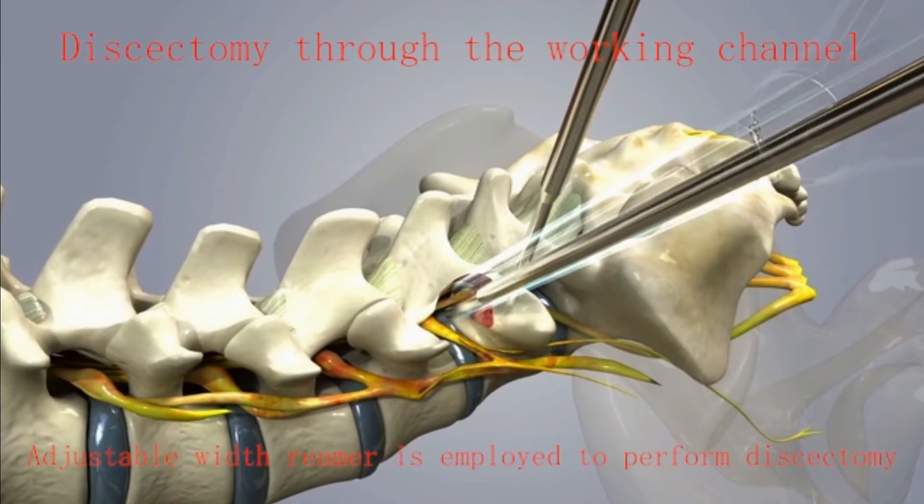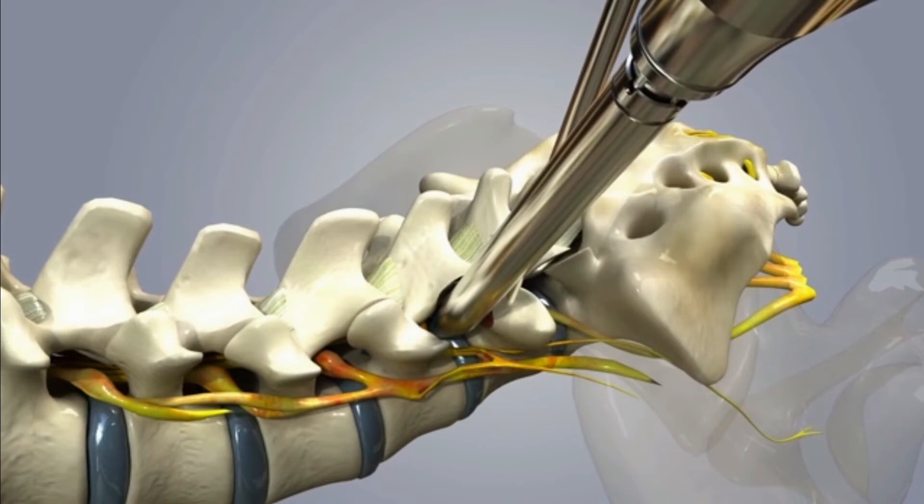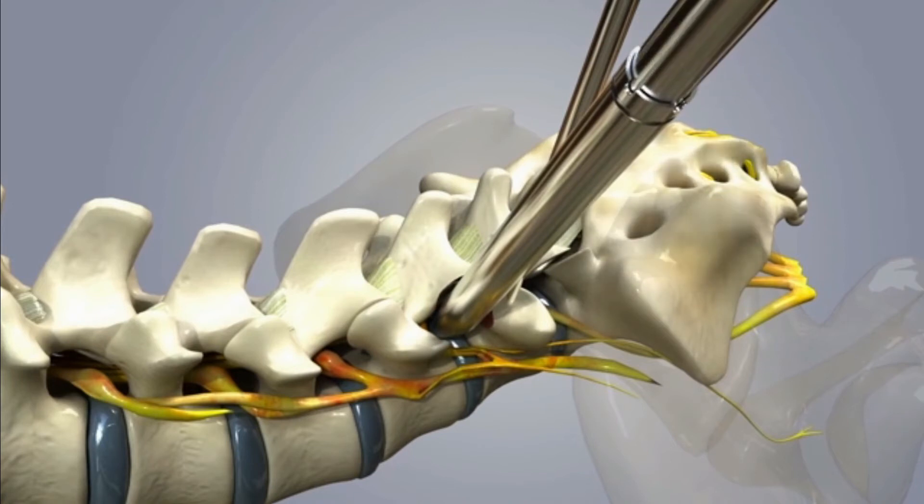Ligamentum flavum dissection was performed and the remaining superior articular process was removed by endoscopic curette or burr drill. Then the canal was decompressed and the nerve root was released.